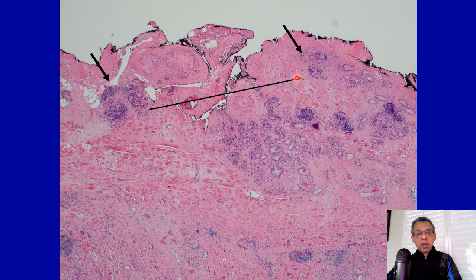So here is an example of the anterior area of the prostate where you can make a diagnosis of extraprostatic extension. You can see that there is clearly a fibromuscular layer. The tumor is going beyond the fibromuscular layer, and in this particular site, it is clearly within the plane of the fat. So with an example like this, you can call extraprostatic extension in an anterior-based tumor.